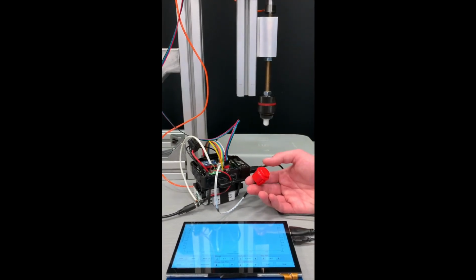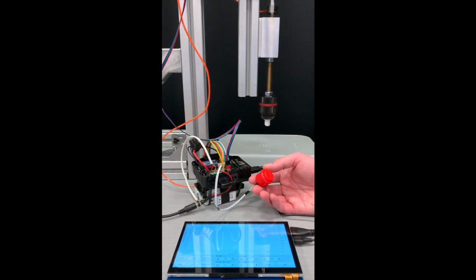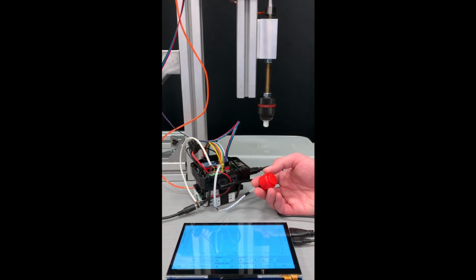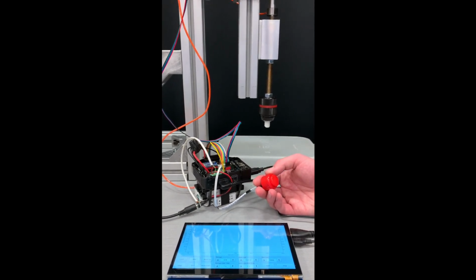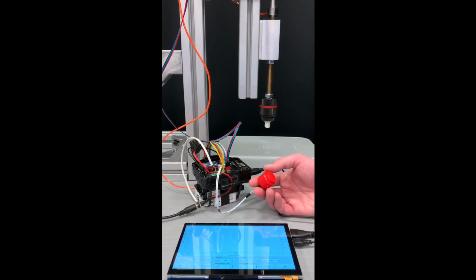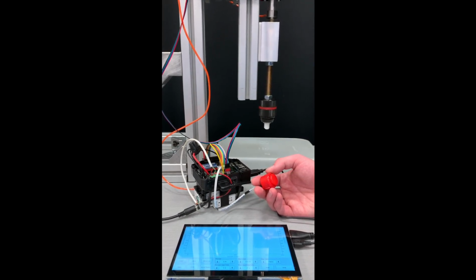Now let's talk about what is arguably the most important feature of the spinal stiffness indenter, the emergency stop button. This button allows us to quickly cancel a measurement and retract the indenter head. If we had a case for the device, one of these buttons would be embedded into that case, and the patient would also be given one of these buttons. Let's see how it works.